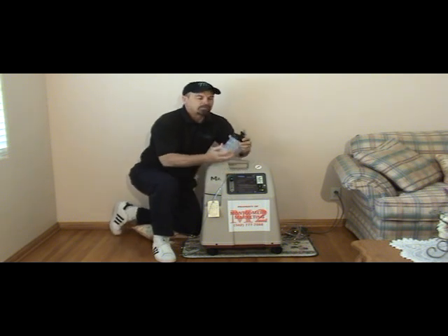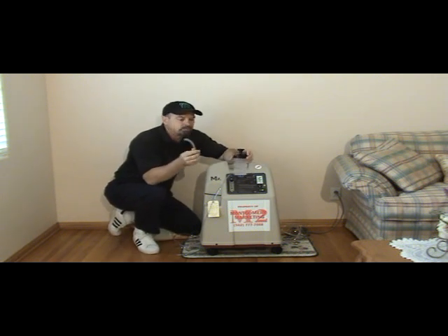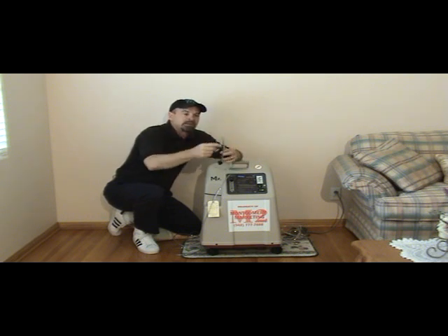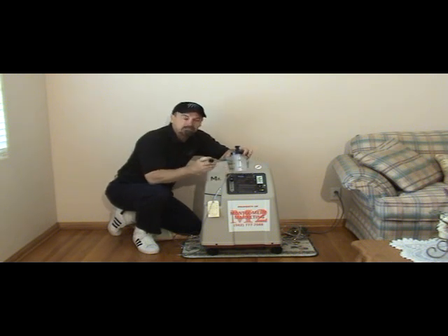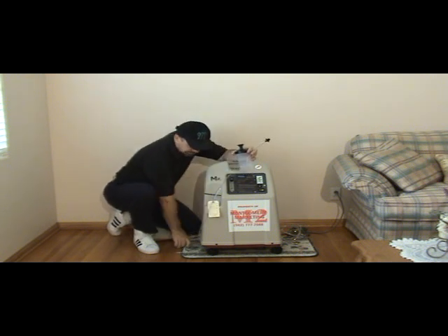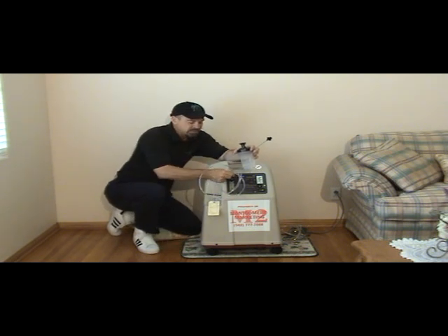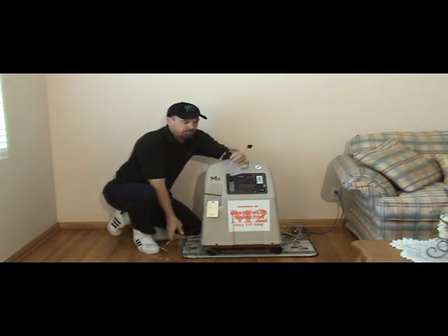The way this humidifier bottle works is you have a piece of tubing here. This tubing connects with the black connector to the top of the humidifier bottle. Then the other side of the tubing hooks onto the concentrator. So if you're using a nasal cannula, as we have hooked up here, and you need humidification, first thing you do is disconnect the nasal cannula from the unit.